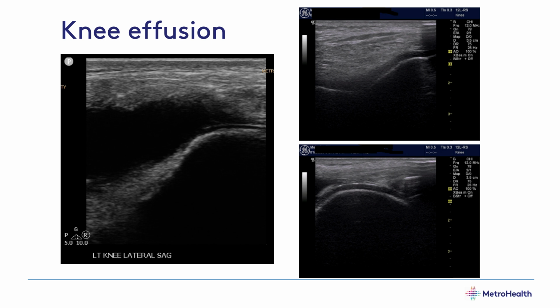So this is a so-called suprapatellar maximum flexion suprapatellar transverse. We just bend the knee to get the patella out of the way, and you lay the probe down just above the patella into the femoral groove. So you see the femur here, and you see the cartilage, and you see this guy's double contour was really fairly weak, and it's only on the lateral side.